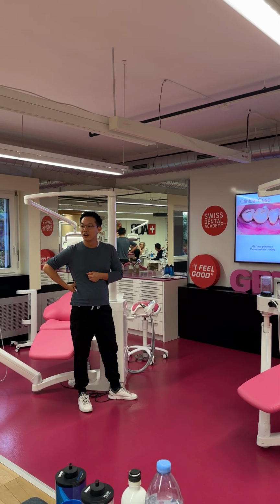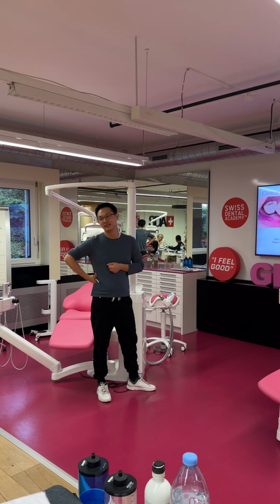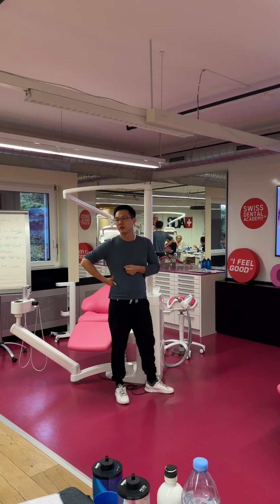What I found with the lingual is if you are angling it down into the sulcus, the water builds up and actually the water stops the airflow removing the biofilm. So you've really got to retract the tongue and go up and then down and do short bursts because otherwise you don't remove the biofilm.